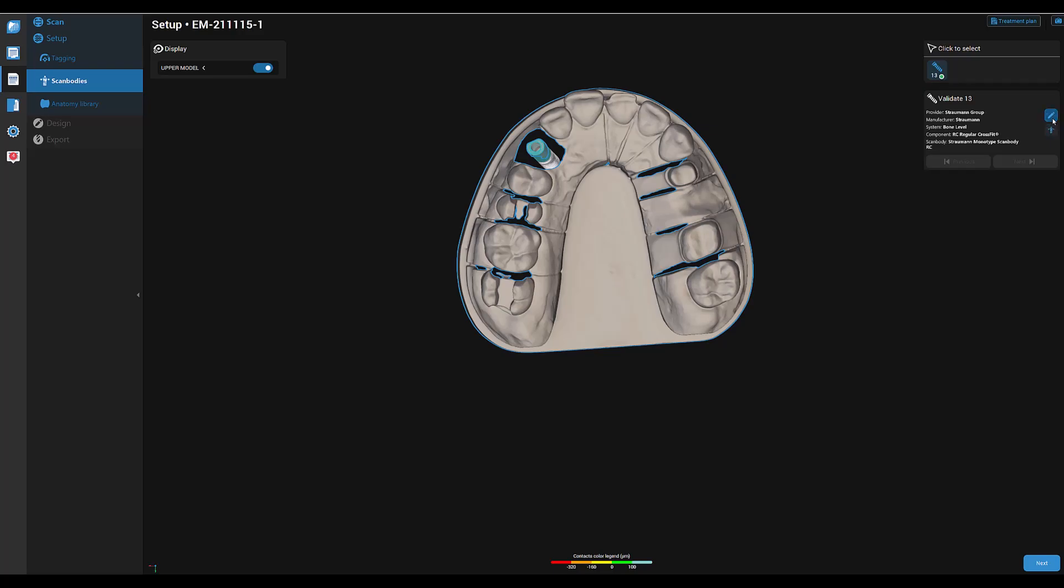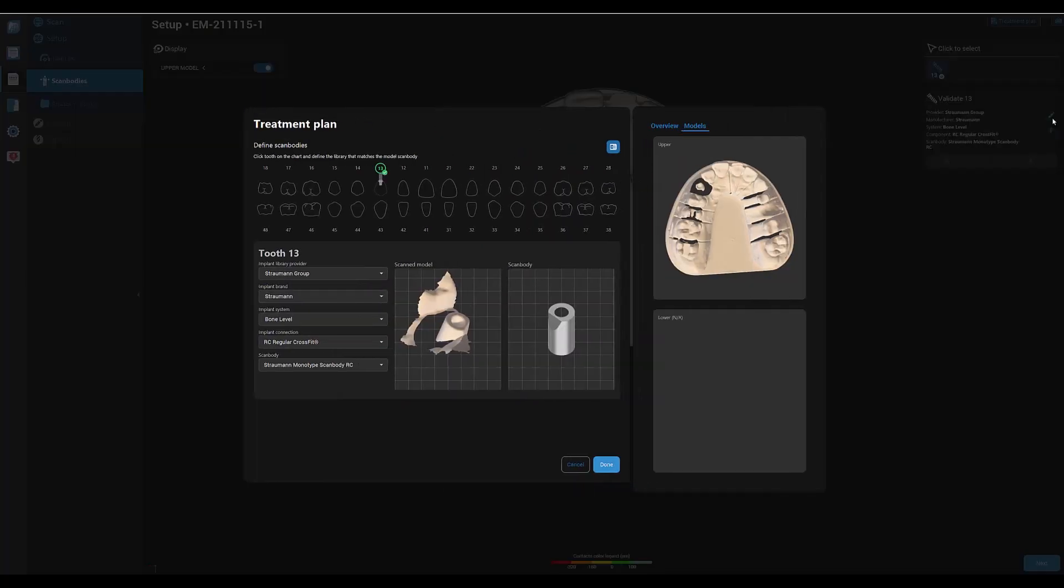If you have to change the scan body because the scan body selection failed, click on the icon and you can select the correct scan body.